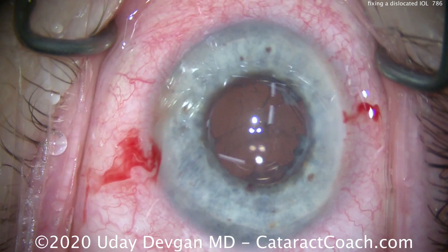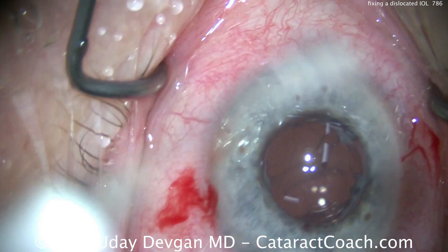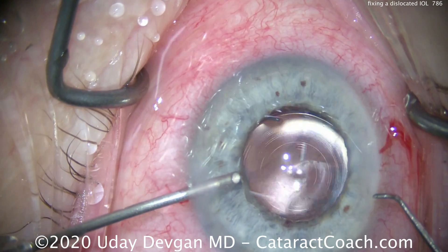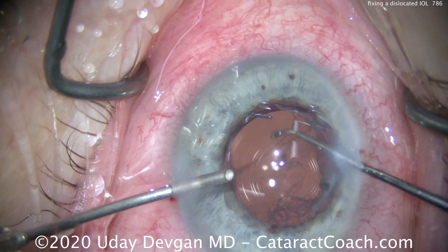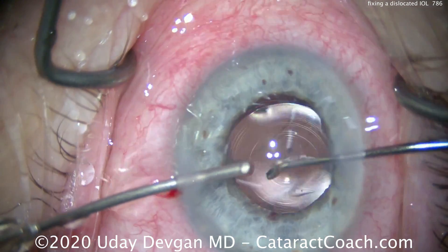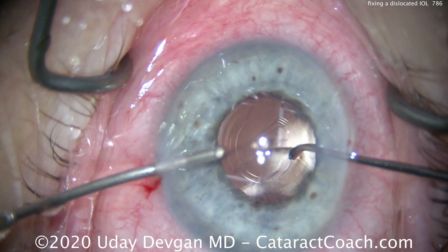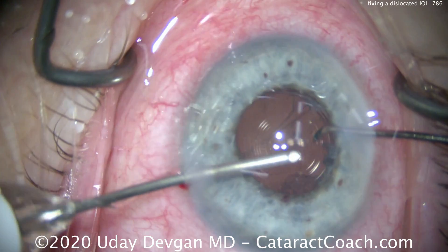That looks pretty good. We seal up all the incisions. We've checked the anterior segment — there's no more prolapsed vitreous. The goal of this procedure is to remove the prolapsed vitreous and get the lens securely positioned and well centered in the visual axis.